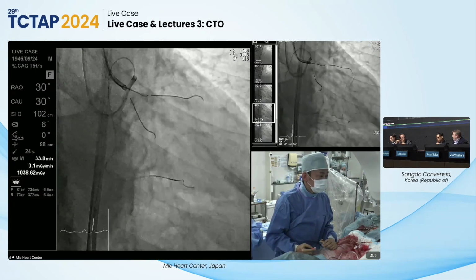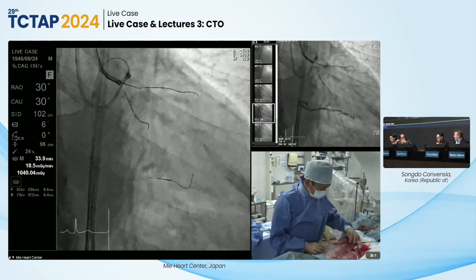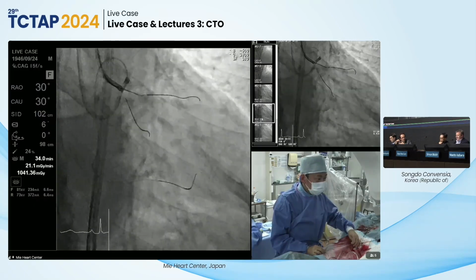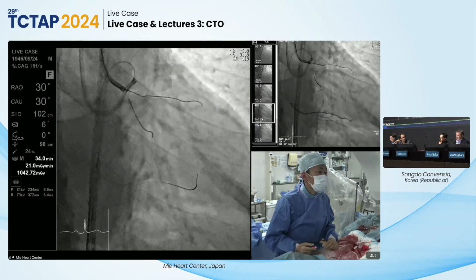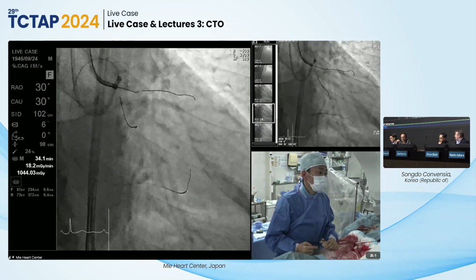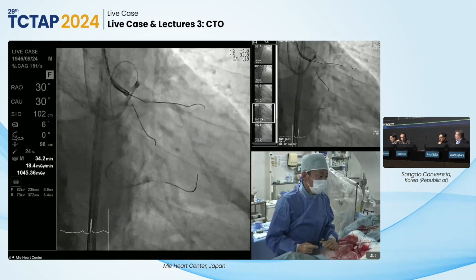I don't have it. Multiplied by, you know, 1,000 per procedure, so it has additional costs. Maybe it's only 10 euro, even if it's only 10 euro, it will be like 2,000 procedures if you take it all the time. Yeah, but at the moment I didn't get the two parties together. But I would like to have Rampart, honestly.